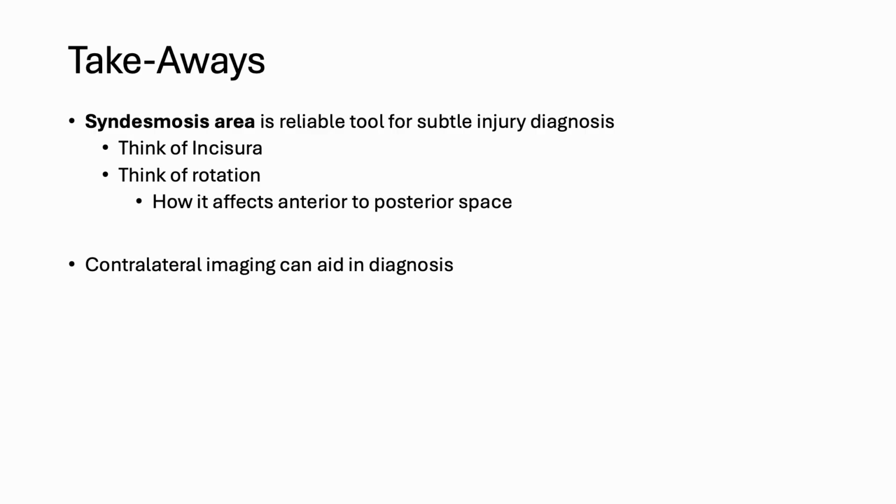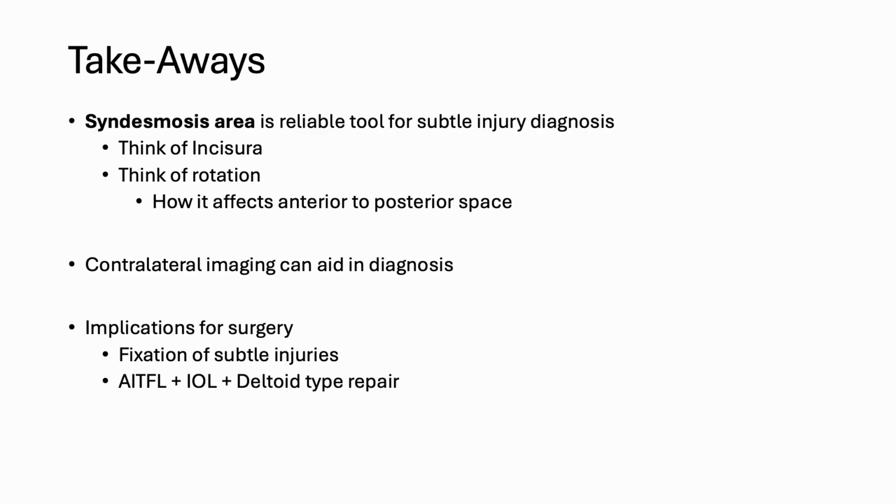Getting contralateral imaging can aid in a diagnosis, especially x-rays initially, and then get them on weight-bearing CT scans. If you have any questions, I would highly recommend finding a weight-bearing CT scan in your region to really help you in your sports med practice.